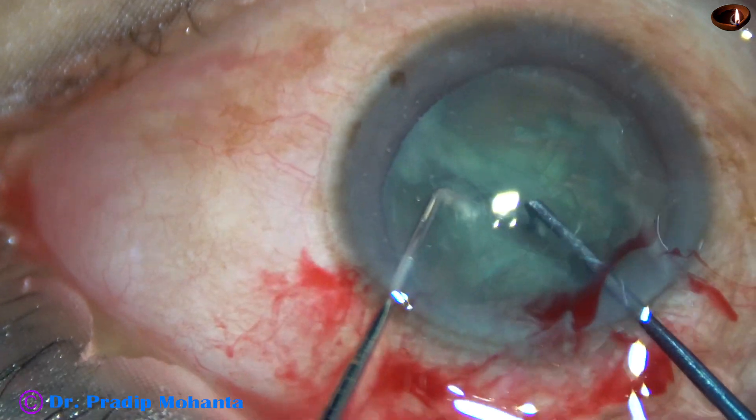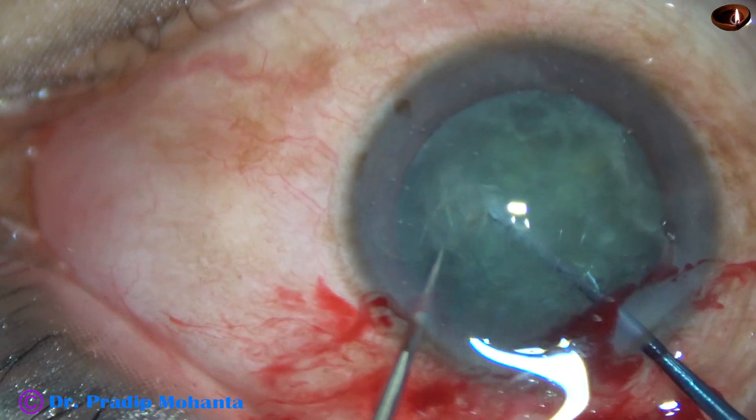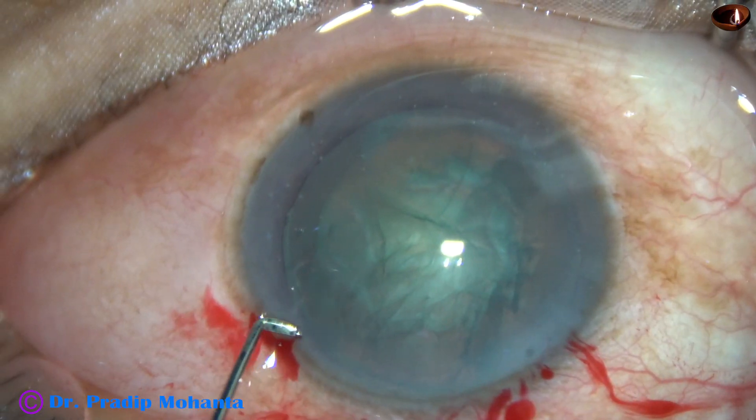And here it is. The nucleus is divided into two halves and then one hemi-nucleus is divided into two pieces. Just these three pieces are enough.